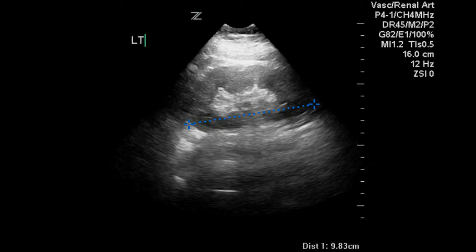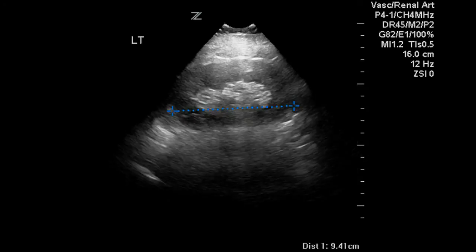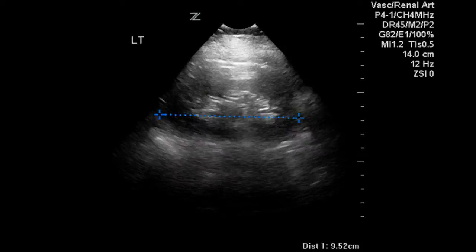We're now measuring the left kidney. We get a 9.8 centimeter measurement. There is a good renal parenchymal thickness here — we want it to be at least a centimeter. Each one of these lines is a centimeter, so this is close to two centimeters across. Additional measurements of the left kidney are all over 9 and in the normal range of 9 to 13 centimeters. The echogenicity and shape of the kidney also appear normal.